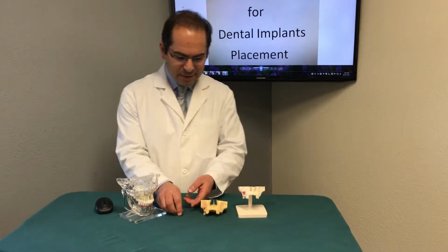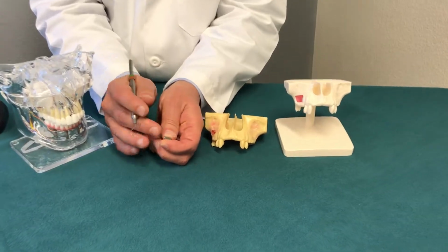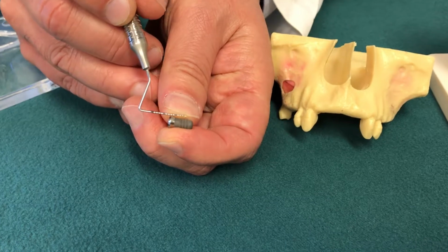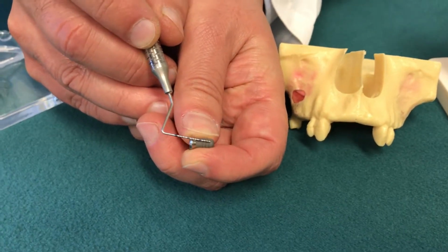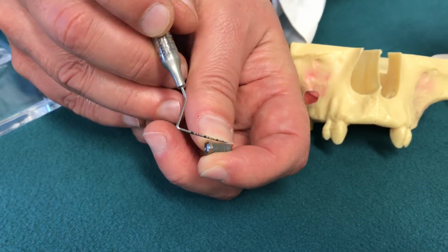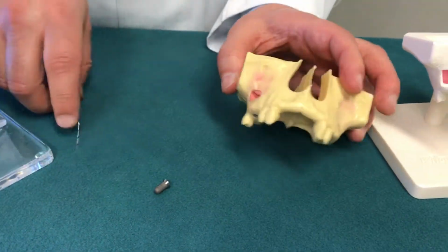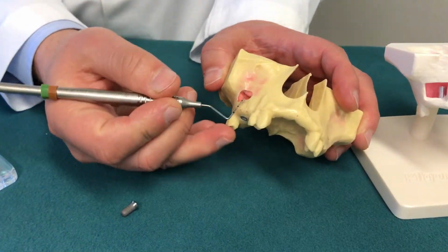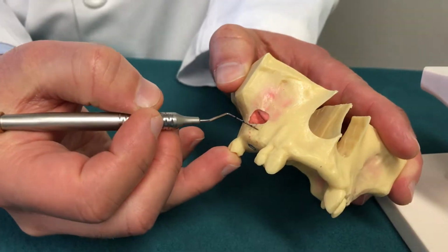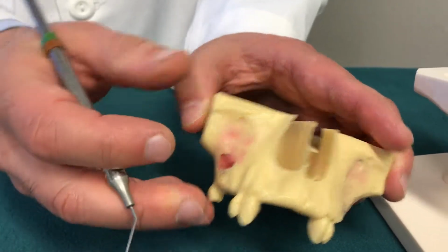Now here is an actual implant. If I were to measure the length of this implant, it's about 10 millimeters or so. They come in different lengths, but we usually like to go for 8 to 10 or 12 millimeters. Now, if I were to place this implant on this jaw area here, and the jaw from the ridge to the floor of the sinus is about 5 millimeters, it will go right through, you see?